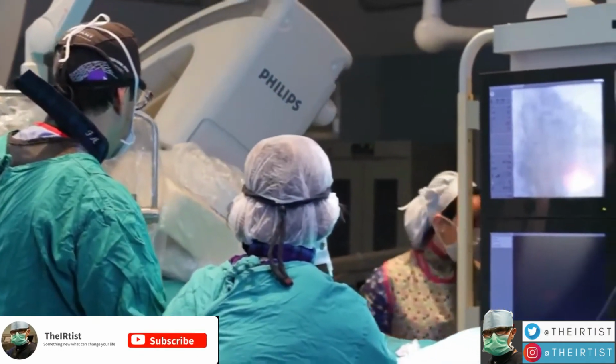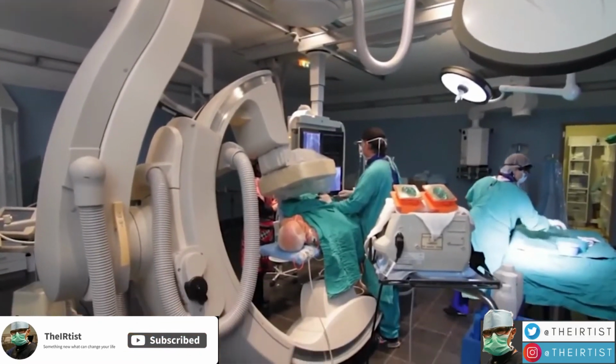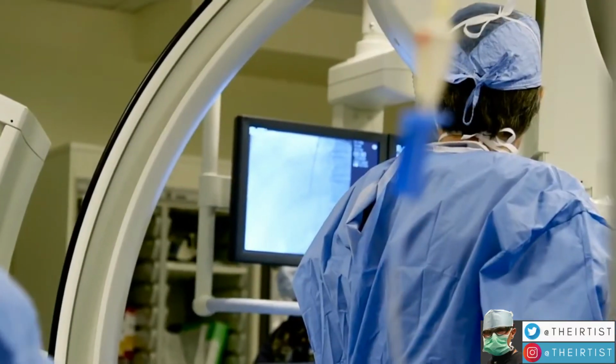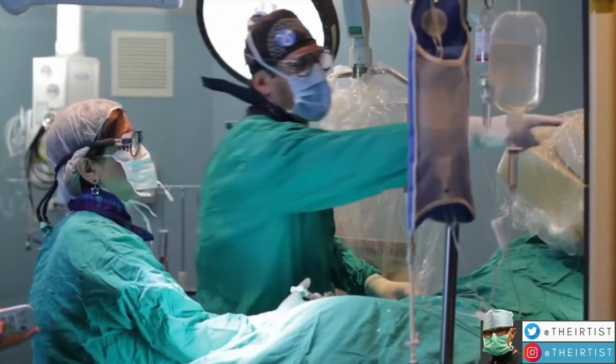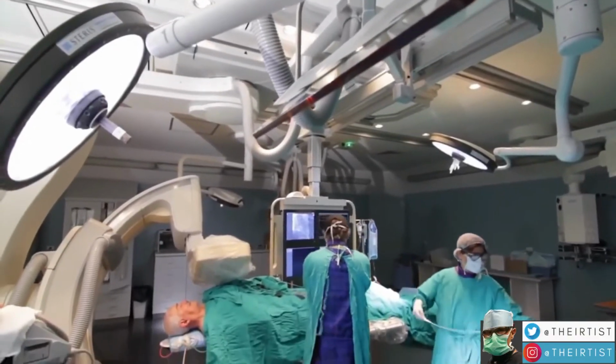So this is a typical angiography suite, and this is how we operate. We operate with machines, by looking at the monitor. We do not open the patient. We do not do any surgeries. We don't do big interventions. We don't need general anesthesia. We are interventional radiologists, so everything is done on the monitor, on the screen, using tiny instruments.